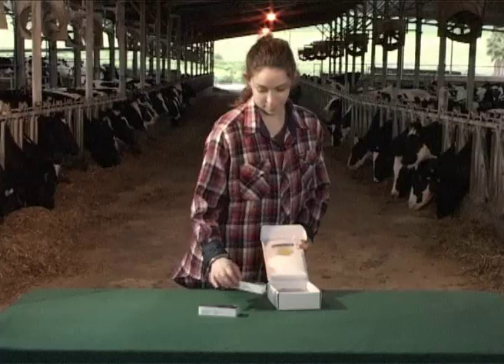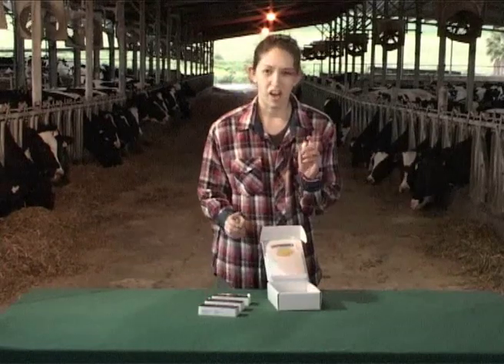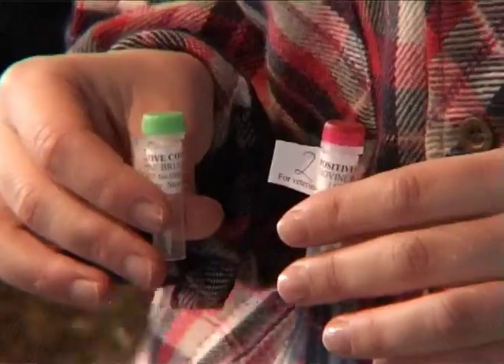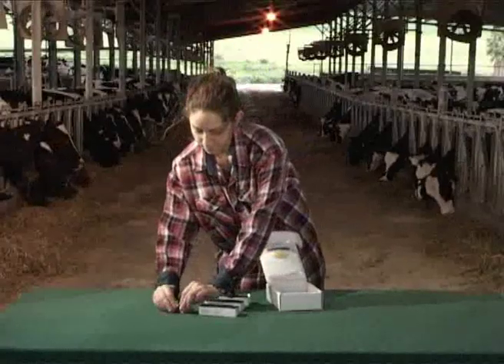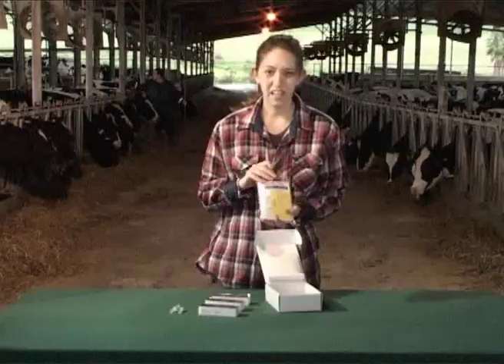The immunocomb kit contains three reaction trays. Each tray allows for up to 10 tests, a positive control and negative control, and instructions.